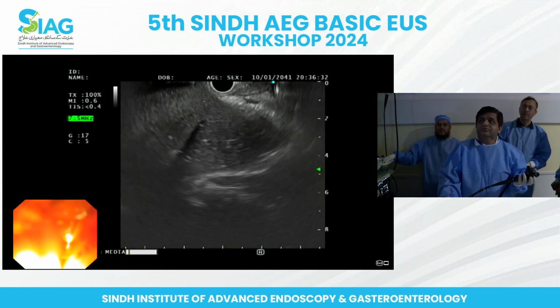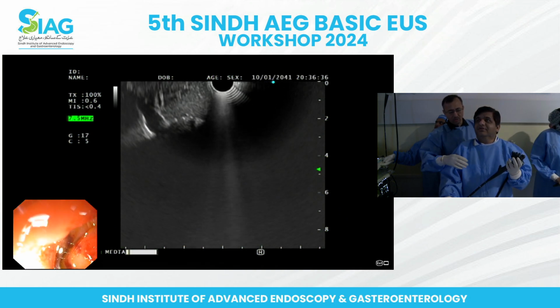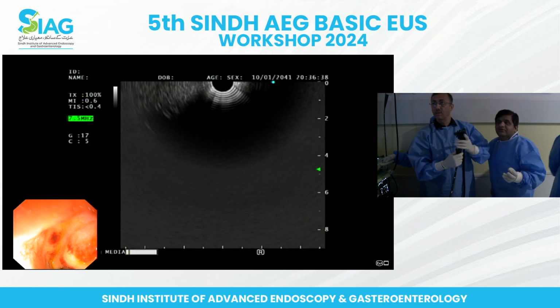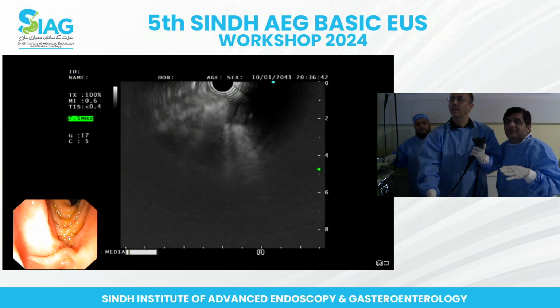Okay, right. Thank you. Look, once again, as soon as you go in, we are going in with the long scope in. Okay, sir.